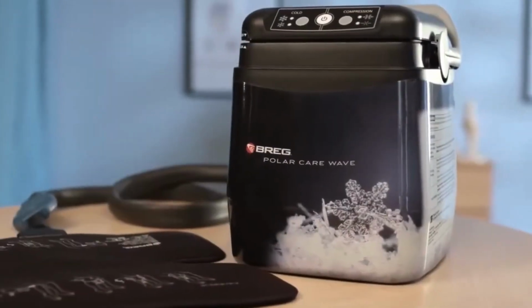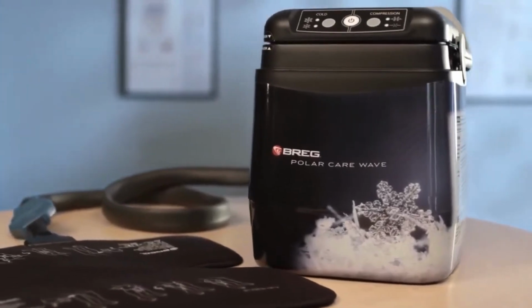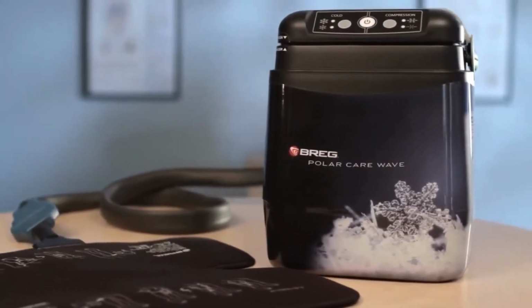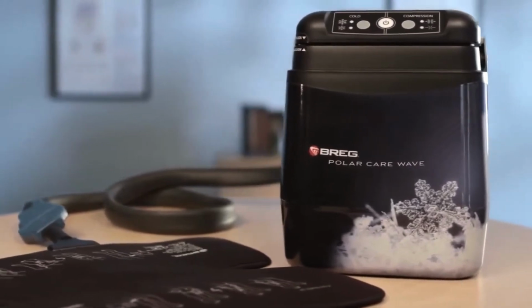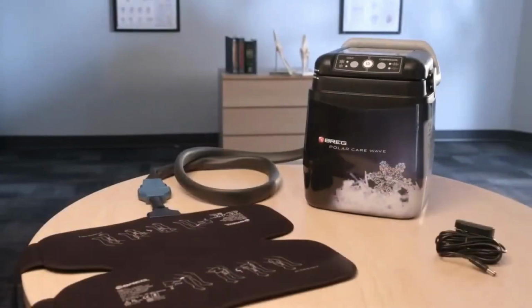The Polar Care Wave is intended to treat post-surgical and acute injuries to reduce edema, swelling, and pain where cold and compression are indicated. The unit consists of three main parts: the container, the pad, and the power supply.